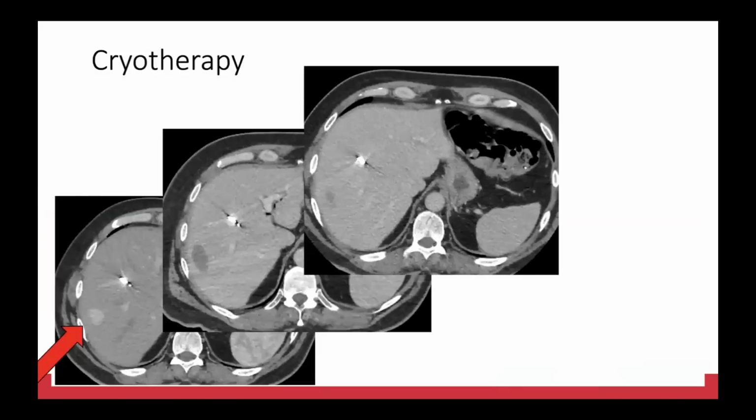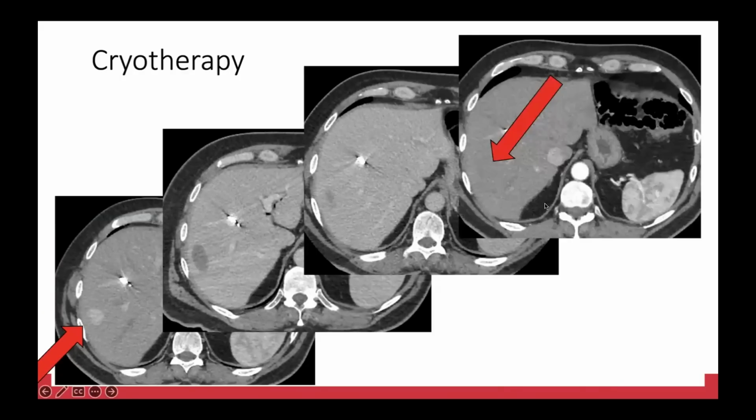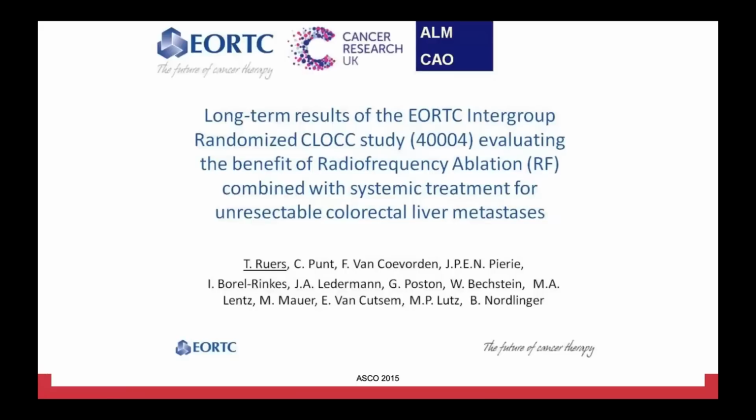This is the cryotherapy for the liver tumor that we did. So far left is the pre, and this is the post in the middle. And then these are the follow-up. You can see that it basically leaves a small scar on long-term follow-up under the effective measure.